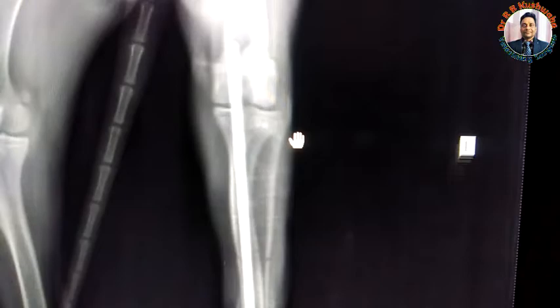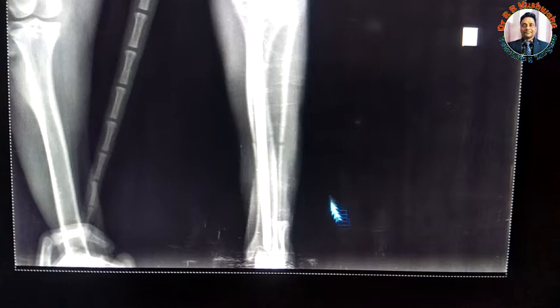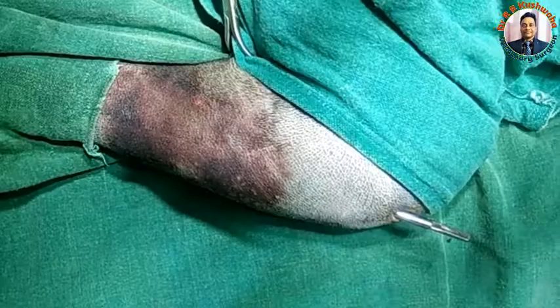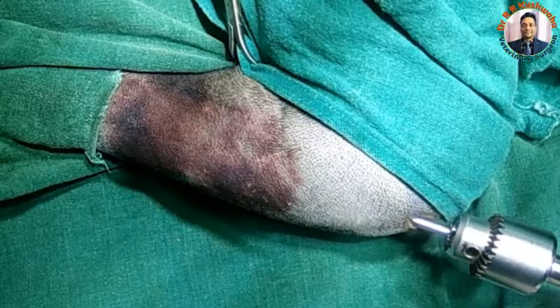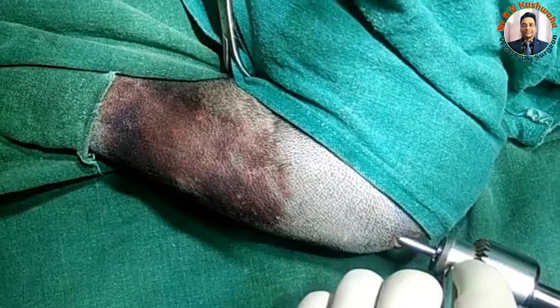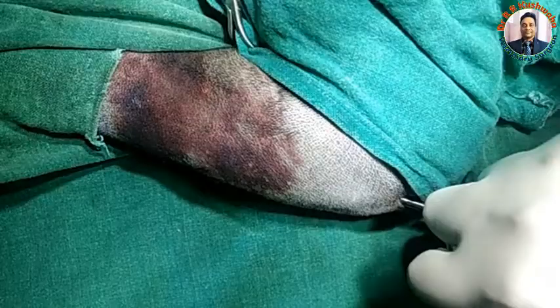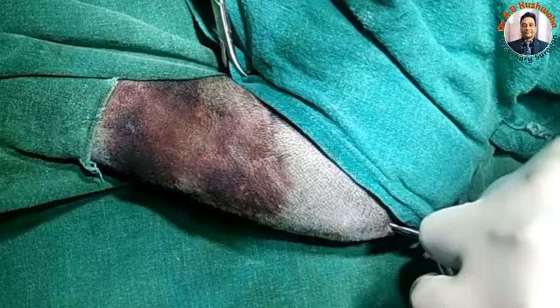This is the proximal segment. Overall I am happy with the fixation. As per the radiograph, the distal end of the pin is fitted very beautifully. Since the fracture is in the mid-shaft, I have the liberty to withdraw the pin slightly, because sometimes during movement it may appear to migrate by a few millimeters.